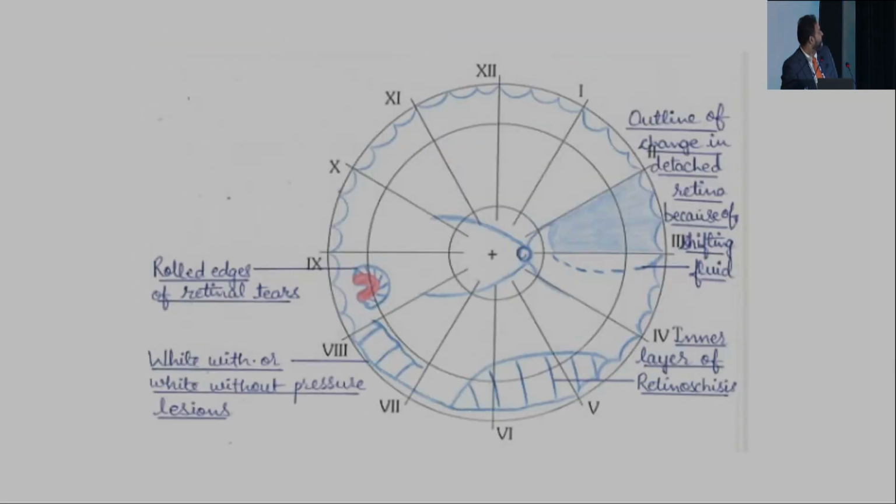This is also, as you can see there, so the breaks, the outlines have to be blue, the center of the break has to be red. You can see retinoschisis. I was asked by someone, so right there is how you would want to show retinoschisis. It's almost like lattice, except you don't make thatches, you just make arrows pointing one side, and if you have 2 layers of your retinoschisis, then the inner layer is angled one side and the outer layer is angled the other side. Now, how you see both on top of each other beats me, but that's what's written, because once you make in a diagram, one layer that way and the other layer that way, it almost looks like a lattice, but that's what it said, right?